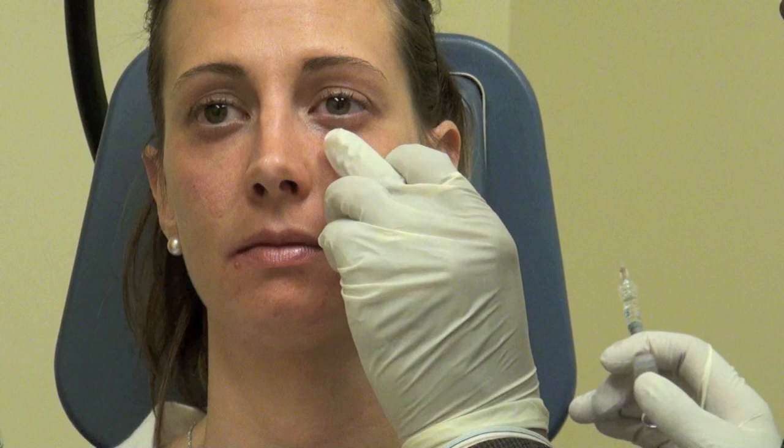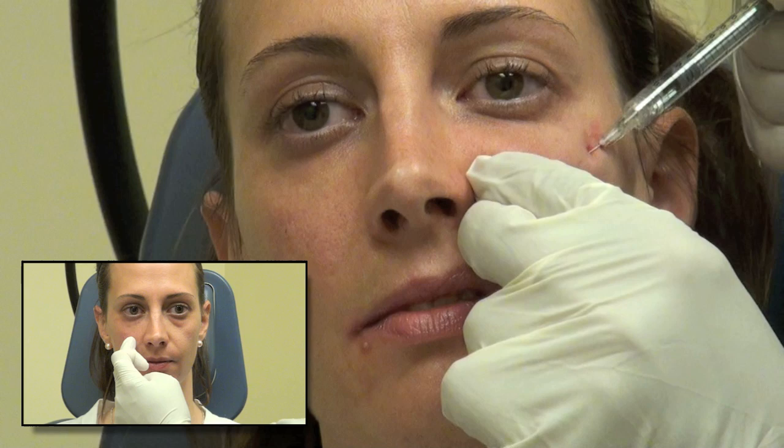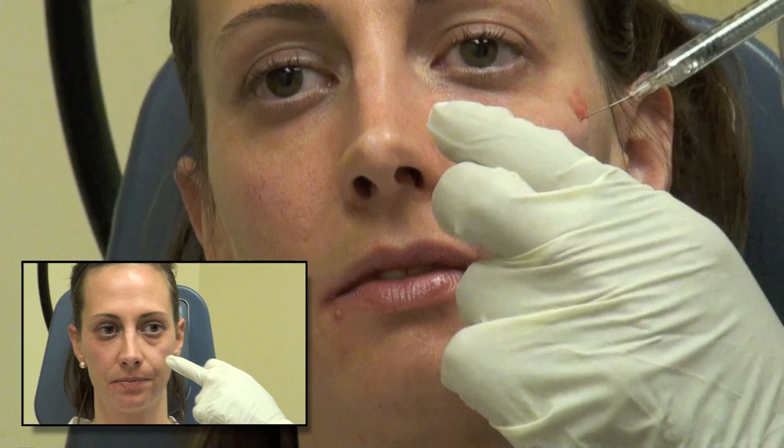Things are going well. We've done the inner corner of the under eye and we're going to go ahead and work into the outside portion of it and into the cheek. For our viewers, there was one syringe of Restylane and two of Juvederm we ended up using. I believe in trying to give people a really good result, so generally when I do three or more syringes, I take a little bit off the price so we can use enough to make a difference, rather than just doing a couple and not making the change.